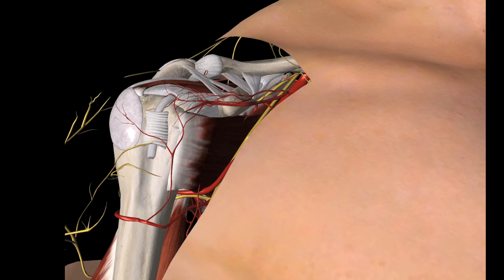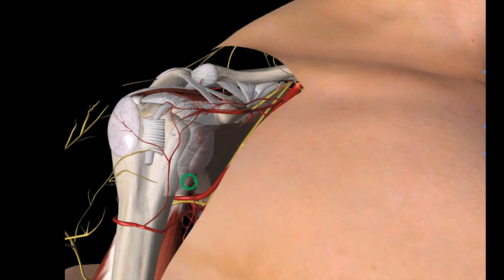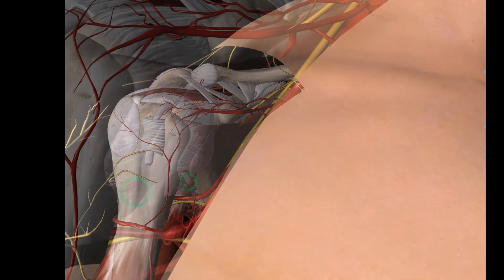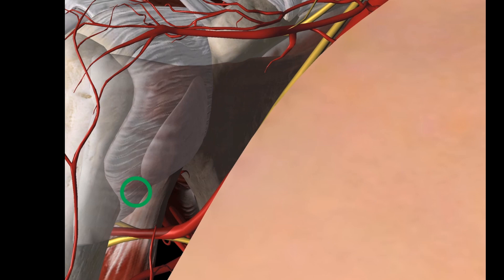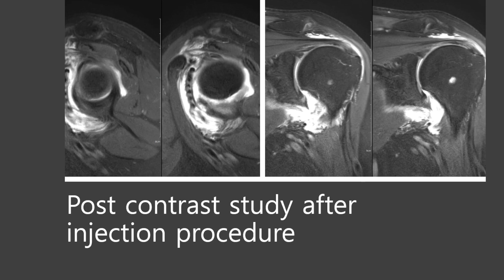A magnified image shows the relationship between the humerus neck, axillary nerve, and subscapularis muscle. Now my needle is in the inferior capsule. You may worry about brachial plexus injury, but it is quite far from it. A magnified image shows the relationship to the brachial plexus, axillary nerve, and humerus. With this injection technique, I confirmed successful contrast infiltration into the inferior capsule, extracapsular structures, and intra-articular space.